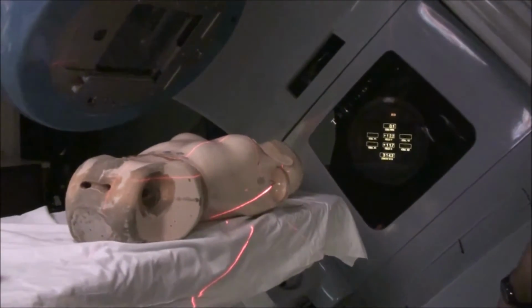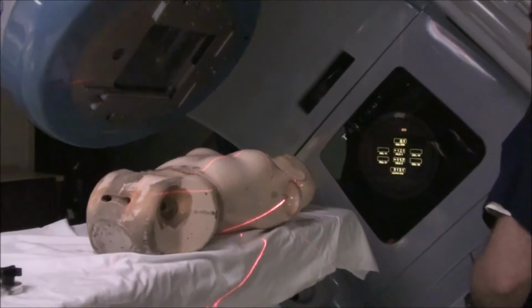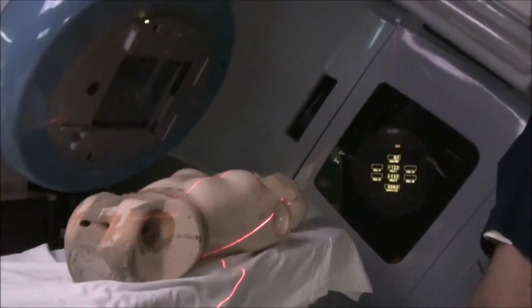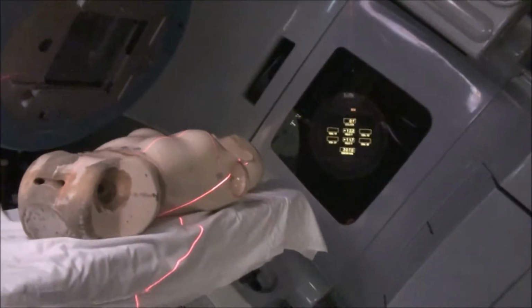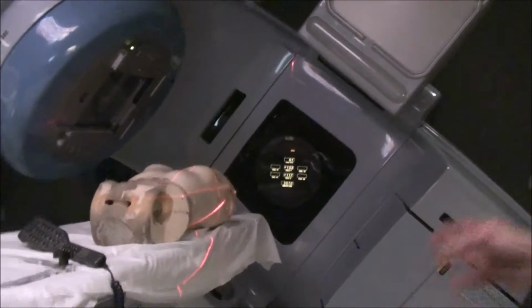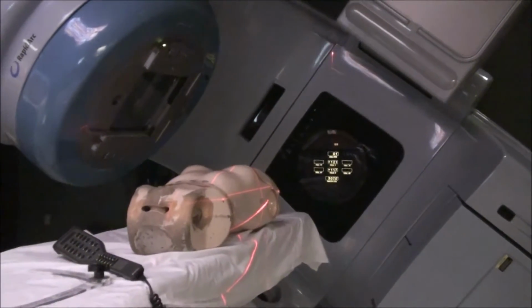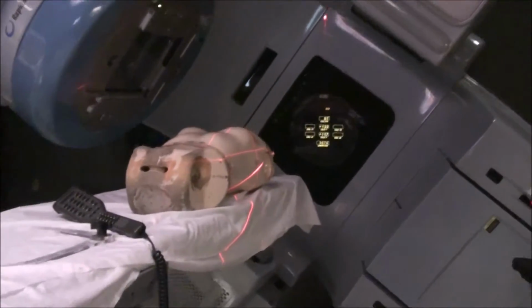Once again, I'm going to stop right there. I don't have the image intensifier out. I should probably put that out in this particular case. But as you can see, this is about what your gantry angle looks like for most breast treatments.